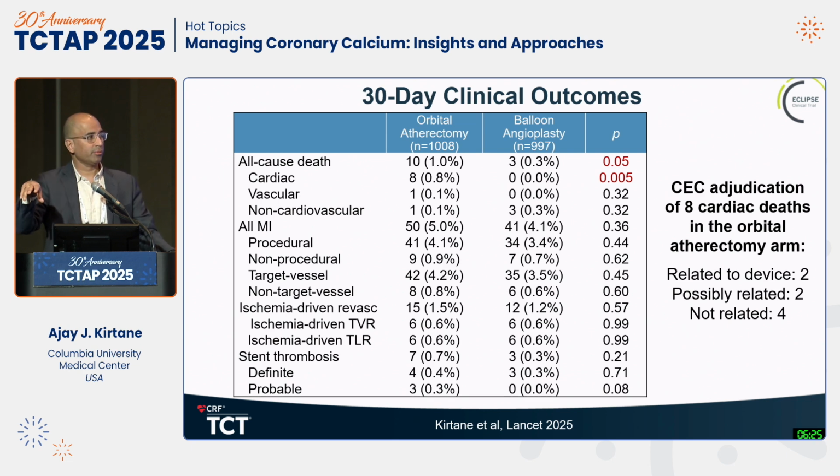Atherectomy was done of multiple circ branches, and then atherectomy was done of the right coronary artery after that, and sure enough, the patient had hemodynamic compromise about 6 hours later, because we know that atherectomy causes embolization. So all these cases you need to do very carefully and be selective about it.